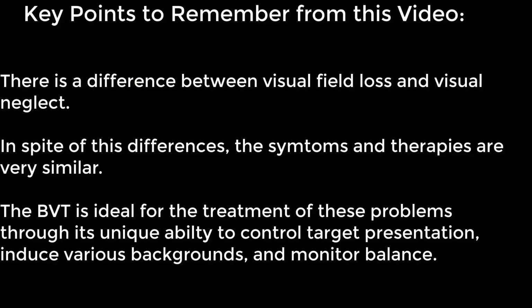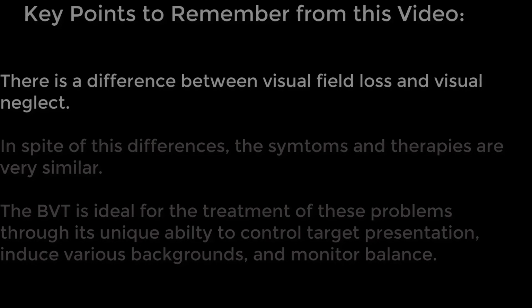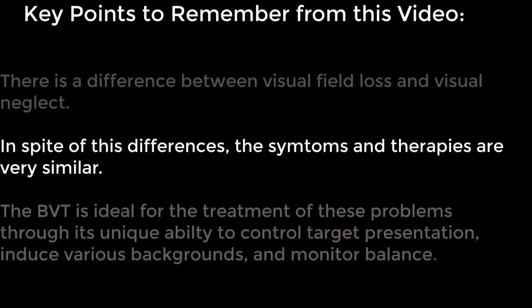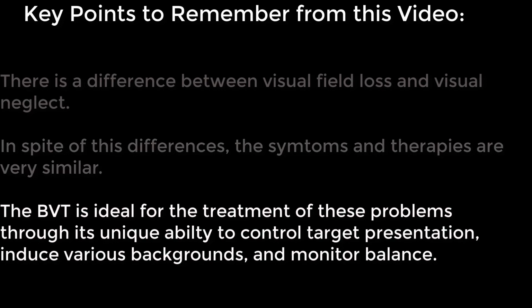The key points that we want you to remember from this video is that there is a difference between visual field loss and visual neglect. And in spite of these differences, the symptoms and therapies are very similar. The BVT is an ideal instrument for the treatment of these problems through its unique ability to change the target presentation and the video backgrounds.